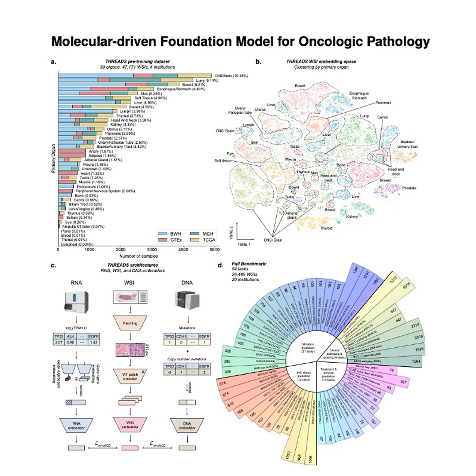It worked remarkably well. They demonstrated this by building prompts for IDH wild type versus IDH mutant status using data from one cancer dataset, like TCGA. Then they tested these prompts instantly on a completely separate, external, unseen dataset. And the result? They achieved a very high classification accuracy, measured as AUC, of 0.960, near perfect classification, essentially zero shot, without any task-specific visual training needed for that particular dataset.